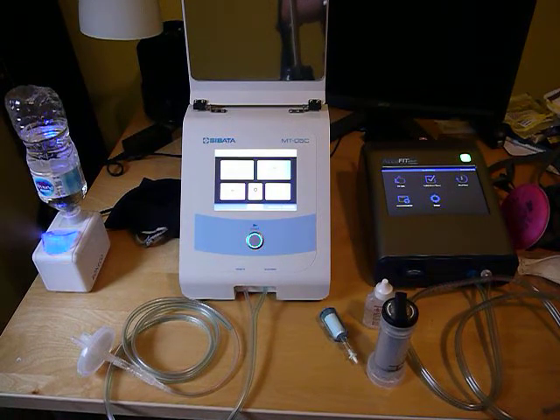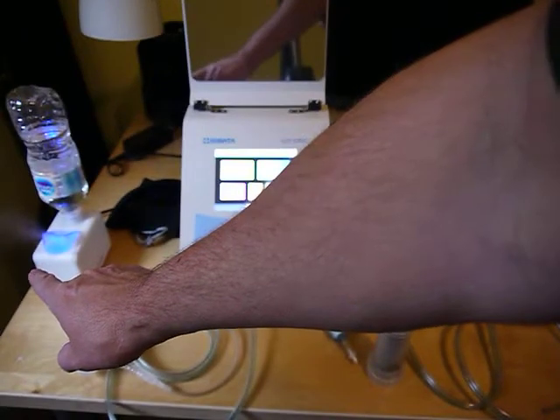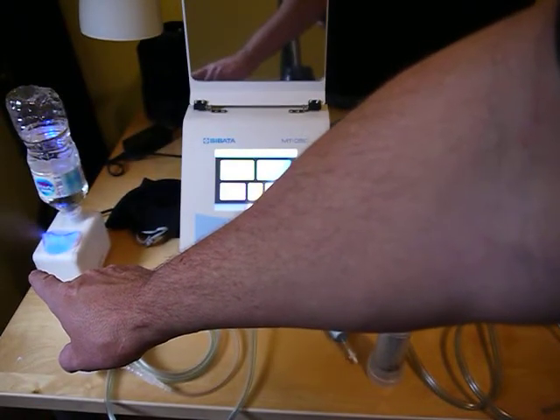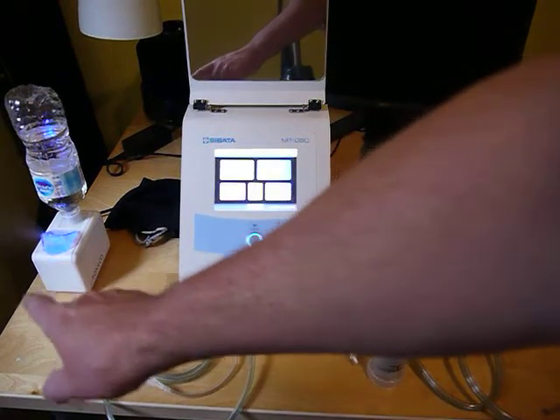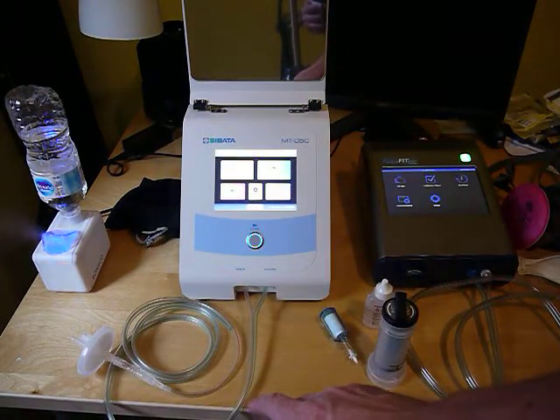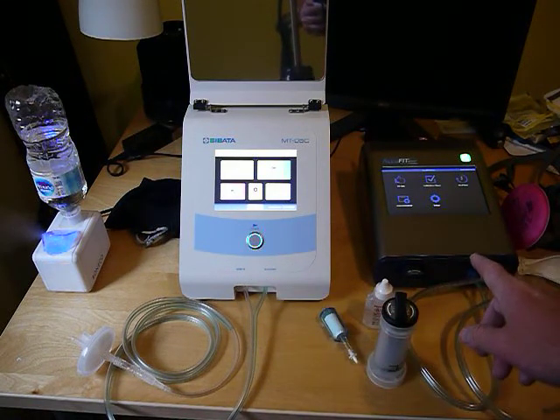This video covers some troubleshooting ideas for fit test machines. I've got my particle generator over here with water and a salt tablet that's been put in there and mixed. Normally that would be further away from the units, but I've set it up this way for now. I've got the Sibata MT-05C and the AccuFit 9000.